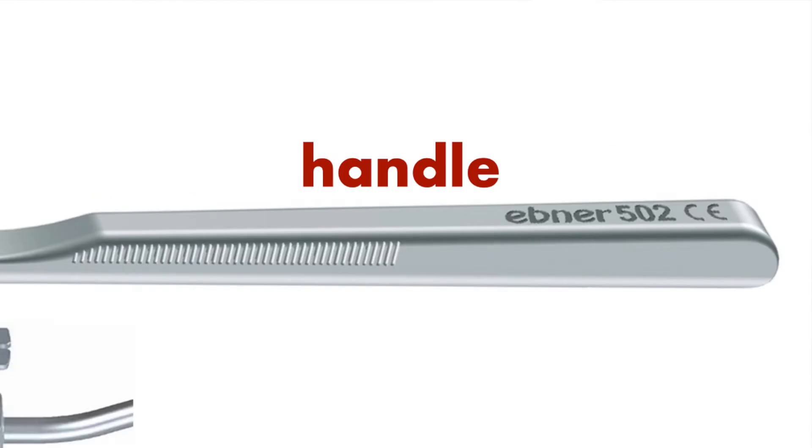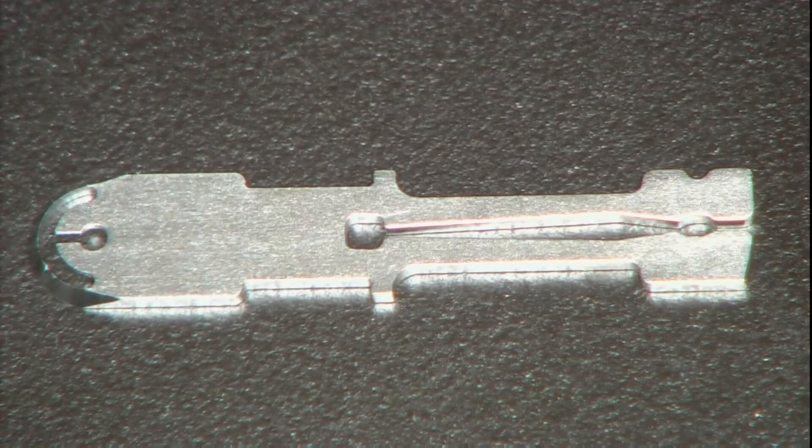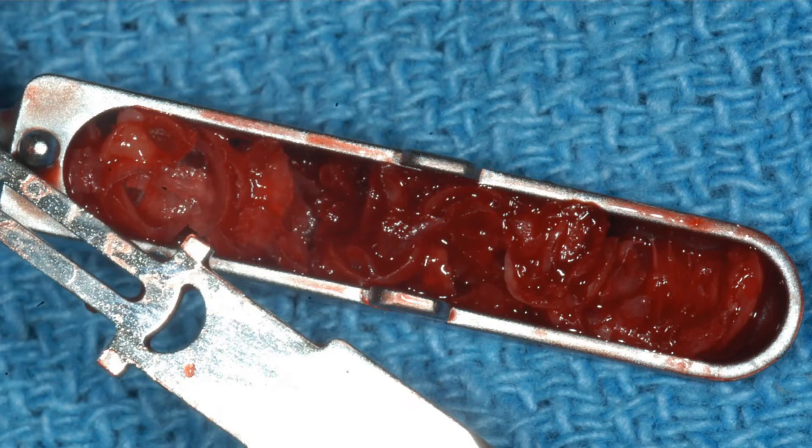Bone scrapers come either as a disposable or a reusable instrument with replaceable blades. They both have three main components: the handle, the working blade, and the collection chamber. The angle of the handle is important, as depending on the donor site it can make access and harvesting much easier. The blade scrapes the bone, so its size and sharpness impact the quality of the harvested bone, and the chamber is where the scraped bone is collected.